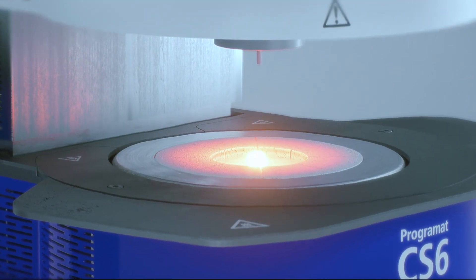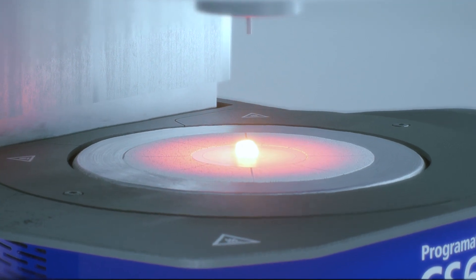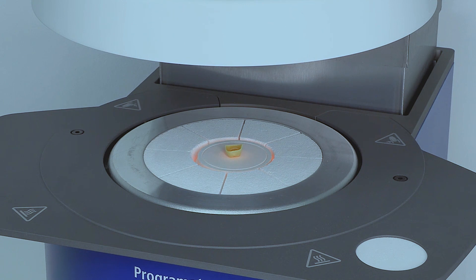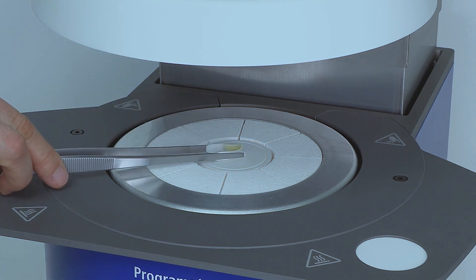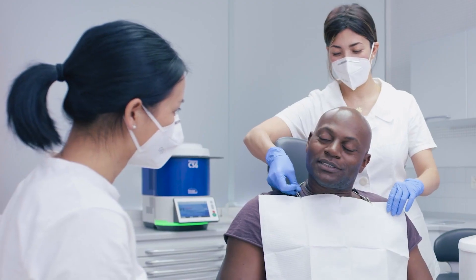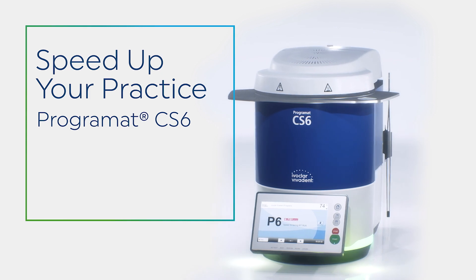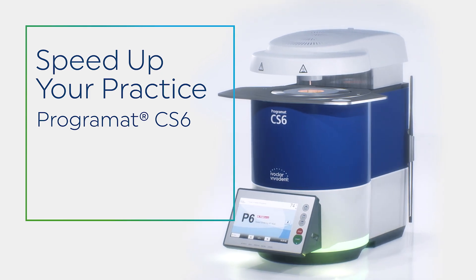PROGRAMAT CS6 is a game changer for the quick crystallization and sintering of your chair side restorations. Its dependable and proprietary technologies ensure that every case is quickly and consistently completed so you can focus on your patients, not your furnace. Speed up your practice with the PROGRAMAT CS6.